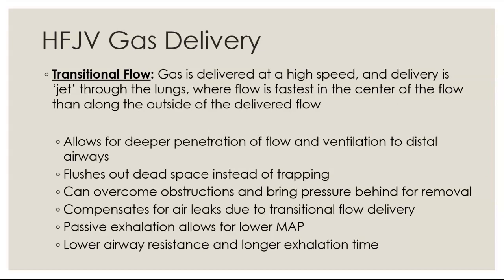High-frequency jet ventilation, gas delivery. So what makes this delivery specific is what's called transitional flow. In every other form of positive pressure ventilation that we're delivering, conventional, high-frequency, non-invasive, all that, we are aiming for laminar flow, which is essentially flow that is just continuous and smooth like a river or a stream of water going. Turbulent flow is what happens when there might be an obstruction, maybe going on our river example, maybe there's a rock in the river and it's causing that flow to turn and churn in some way. Transitional flow is what is specific for high frequency jet ventilation.